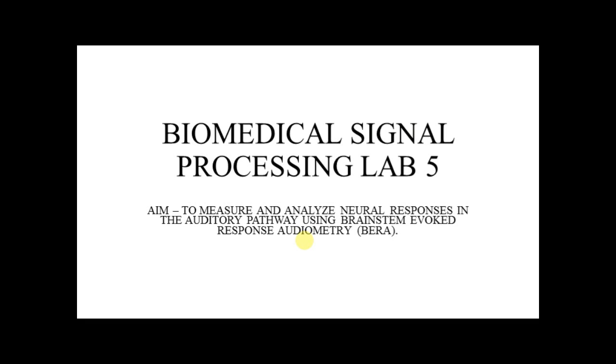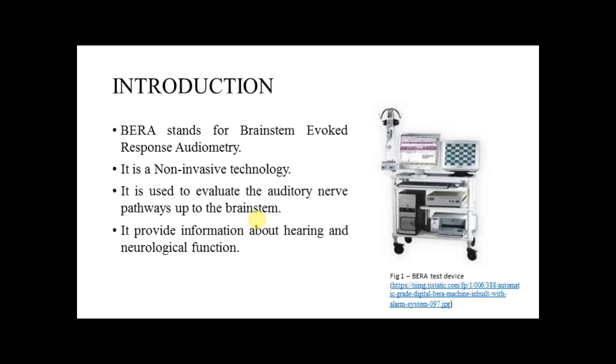So, good afternoon, guys. In today's lab experiment, our aim is to measure and analyze neural responses in the auditory pathway using brainstem evoked response audiometry, which is also known as BERA. So, let's get started. Here is the introduction of the BERA.